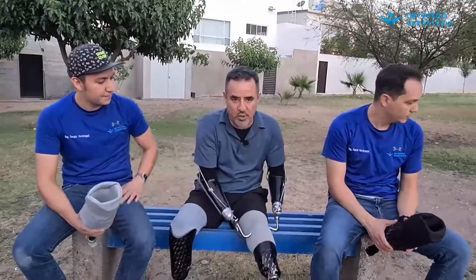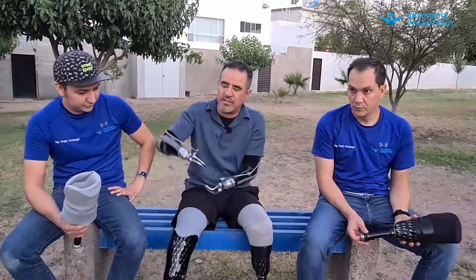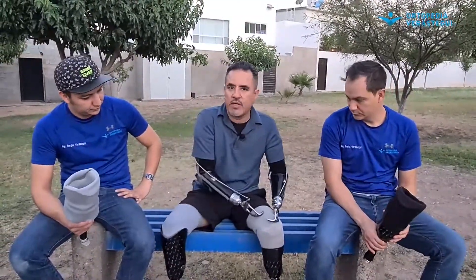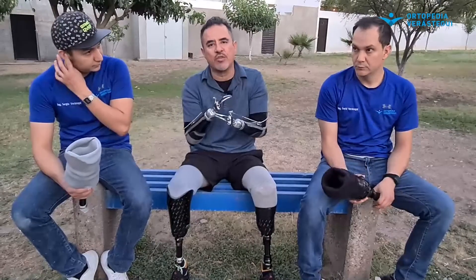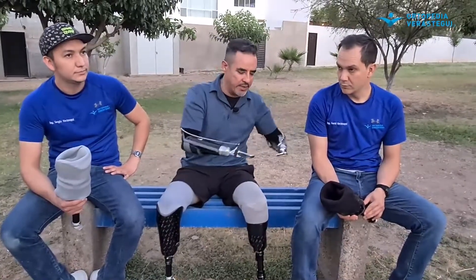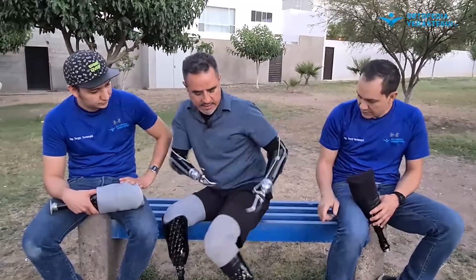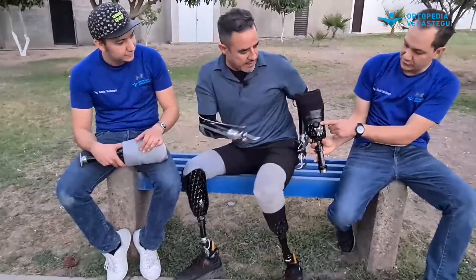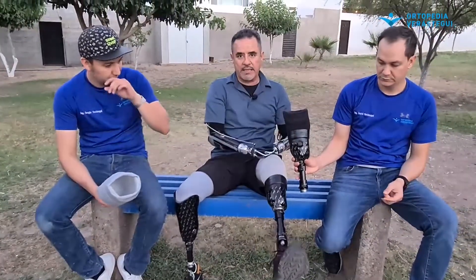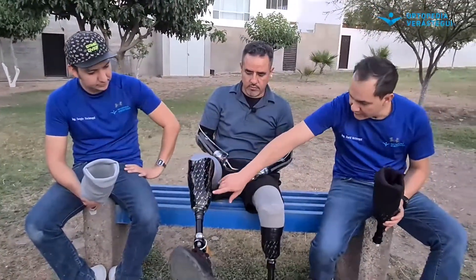Cuando escuchamos sistema convencional, yo usé desde el primerito que es la corredita, fui escalando al pin, y hay muchos sistemas que fui usando hasta este que trae otra top y este que también es vacío, que funciona muy bien. Lo que dice Sergio es cómo la prótesis se sujeta a tu cuerpo, cómo te da la seguridad para hacer movimientos. Este es sujeción por una sola válvula que hace el vacío, y este trae doble válvula, una aquí y otra abajo.